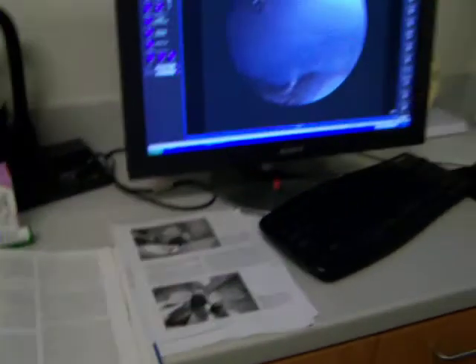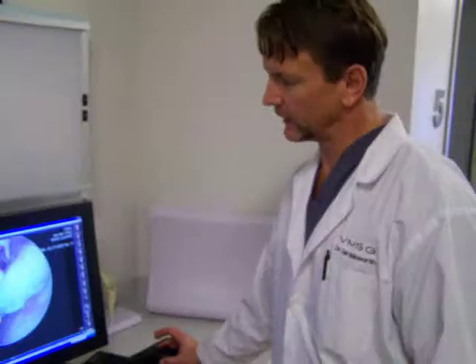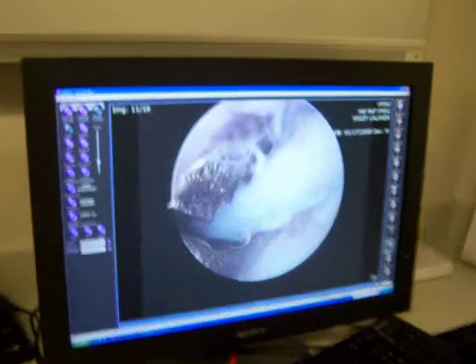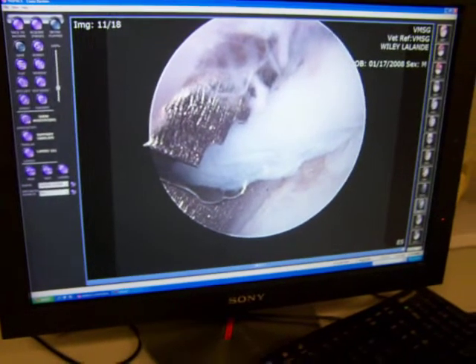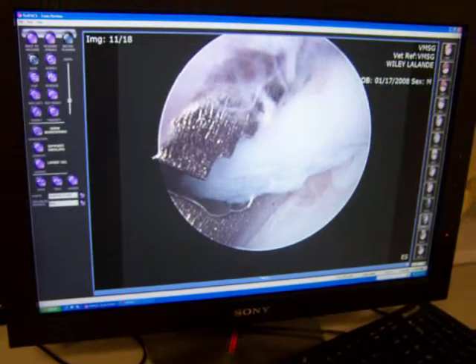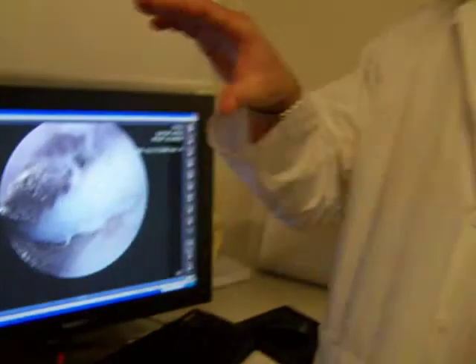And this is after the flap is removed. See there's the graspers here — same type of graspers, grabbing pieces out like that, exactly the same as we did. Here we are — you can see a little bit more. I'm grabbing the flap inside the jaws of the instrument, and there's a little bit of exposed bone where it's coming off.